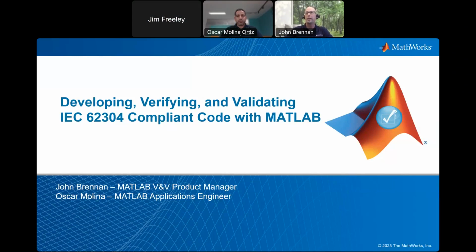and Validating IEC 62304 Compliant Code with MATLAB. So in it, we'll review how you can optimize and improve your MATLAB-based development workflow using the newly released MATLAB Test product, along with some related products.